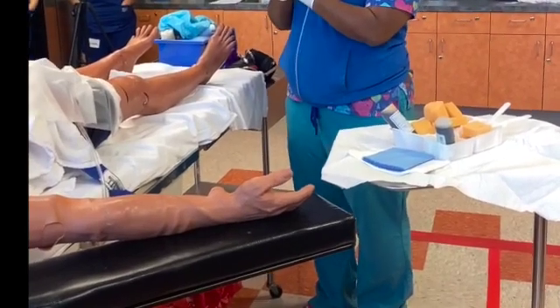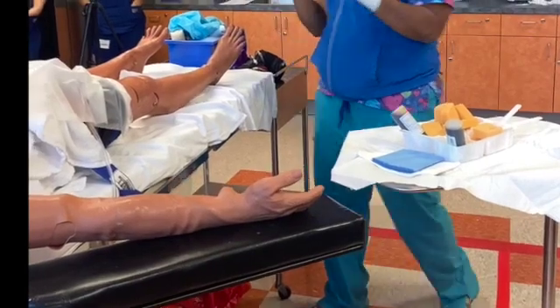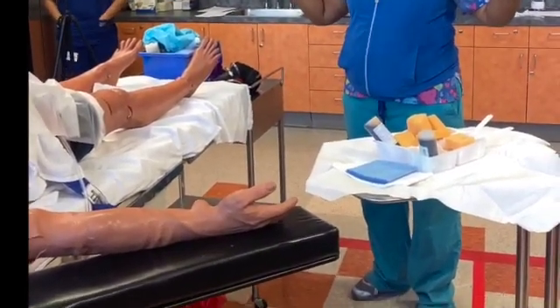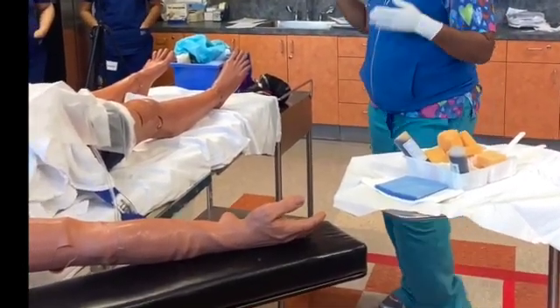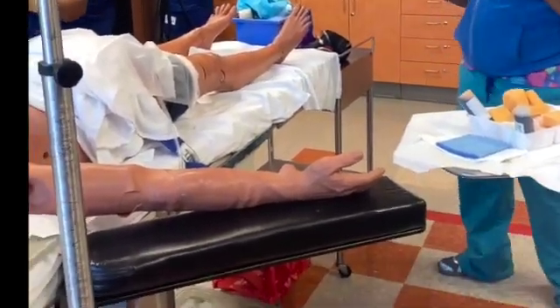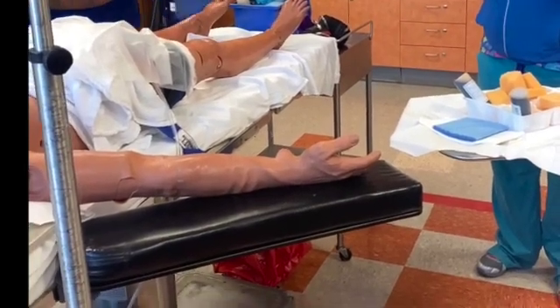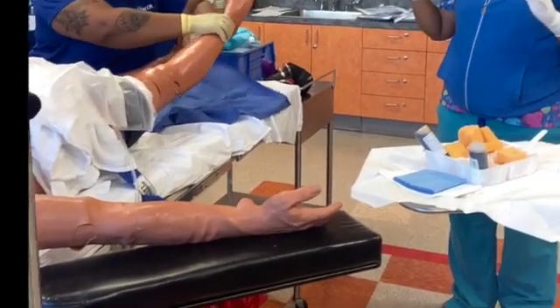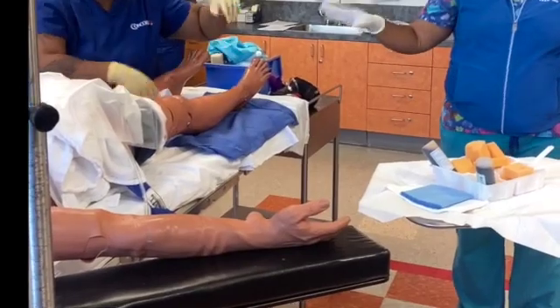Circulator elevates operative leg and places drip sheet over operating table to keep it dry. So, in this case, I have a second circulator. Oh, I forgot to put a chucks down. Hi, extra circulator Bree. Can you do me a favor? Can you go ahead and put a chucks down or towels down under my leg? Yeah, because remember, you're the help. You're not sterile. So just remember to put this down first, okay, guys?